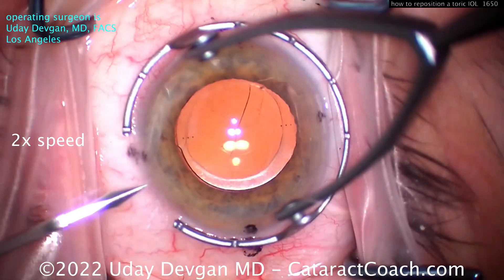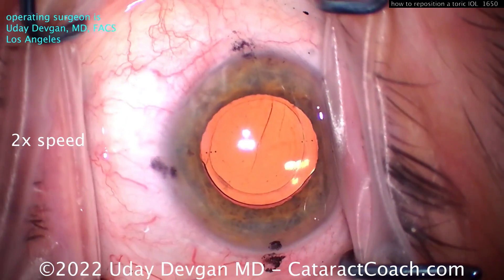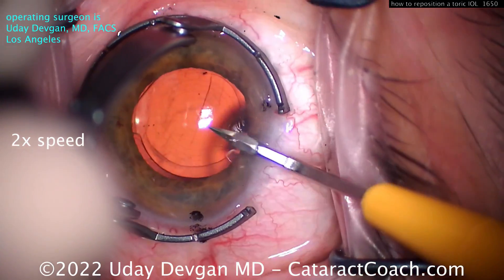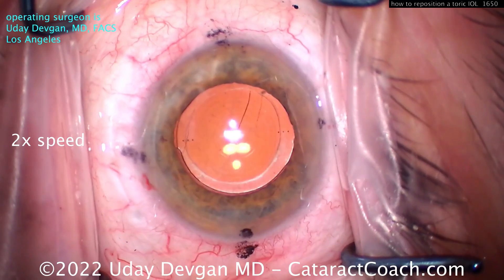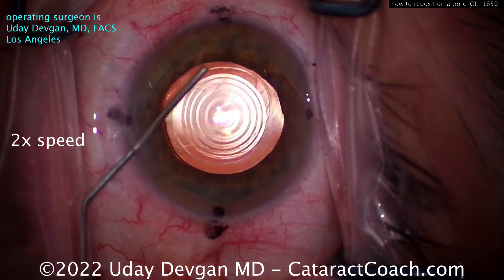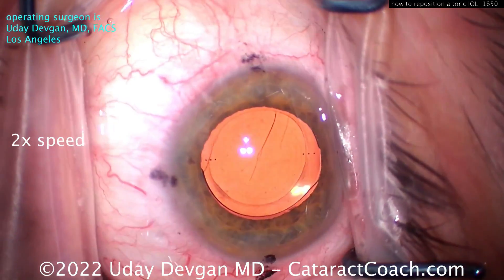The key is to carefully free the haptics. We'll start off with two paracentesis incisions. Notice we're not going to open up the main incision — there's no need. We're keeping the existing lens; we're just going to rotate it into a different meridian. For whatever reason, this lens is rotated about nine degrees away from where it needs to be.